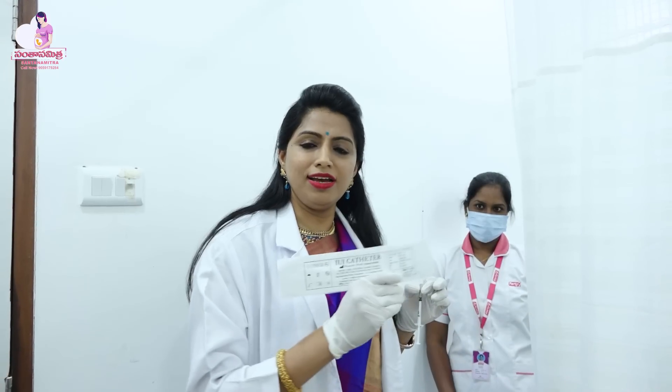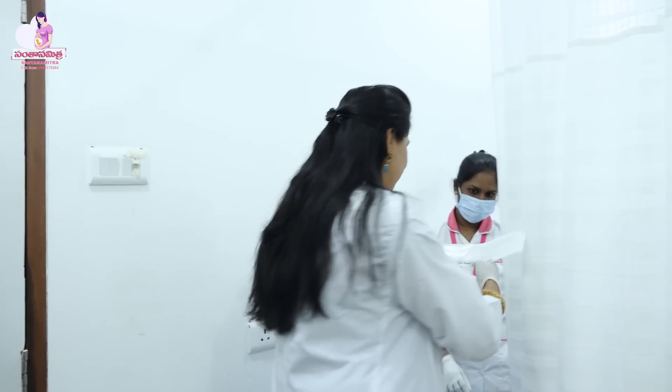Today we don't want her to say the name out loud because that would be a confidentiality breach. That's why we have to thank the patient — she is ready to demonstrate. But we will see the scan and process it. Now we will do the IUI process.